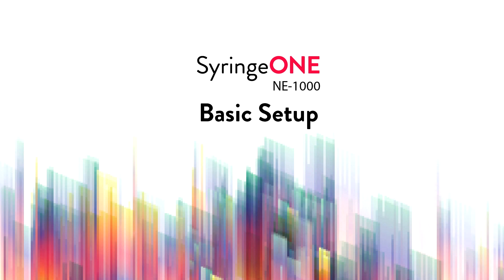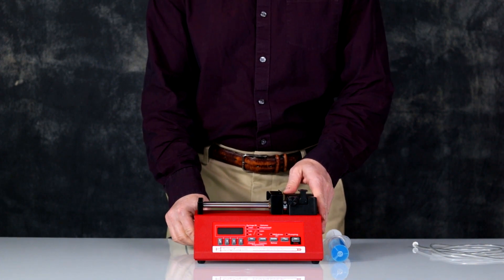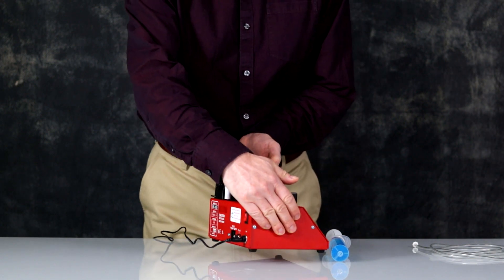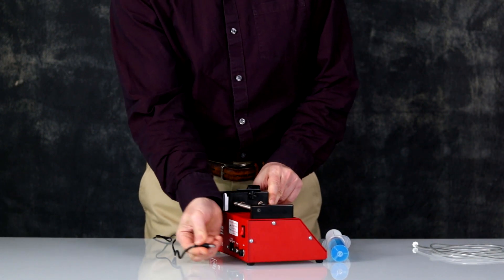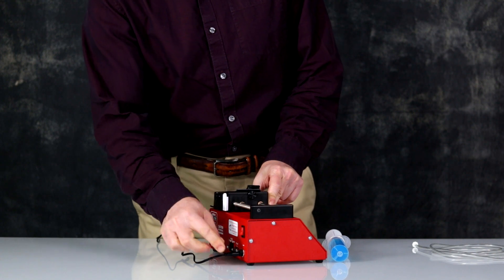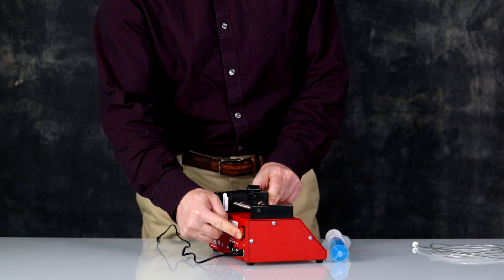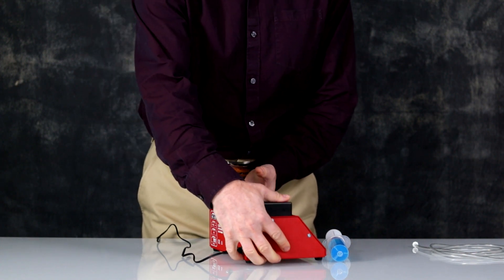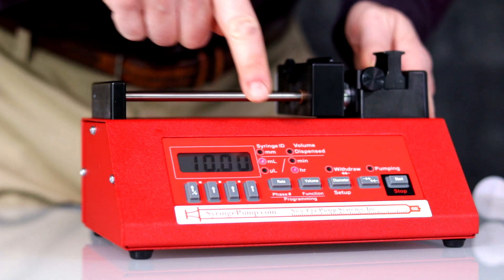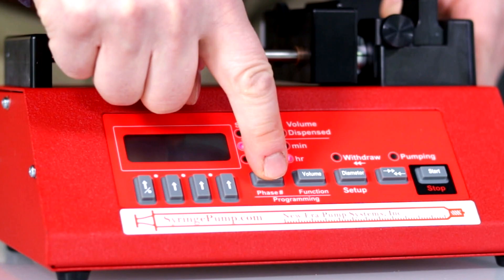NE1000 basic setup. Begin by plugging in your power supply to the wall power or a power strip. If you are using a power strip, make sure the power strip is turned on. Plug your power supply into the round connector at the back of the pump, and then turn on the pump by pressing the switch. You will hear a beep — that means the pump's power is turned on. The display will be blinking and the LEDs will be lit. Press any key to stop the display from blinking.